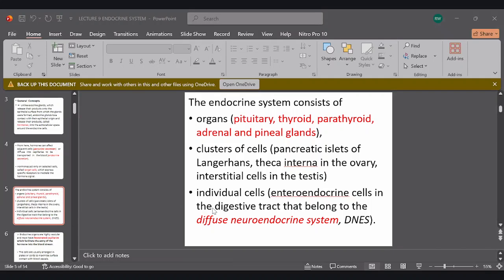I have a question. Yes. What's the difference between the thyroid and parathyroid? Because they seem distinguished by just the prefix, para, in parathyroid.